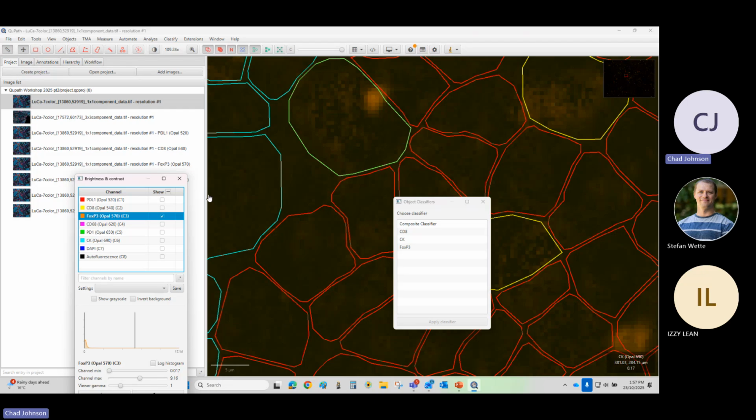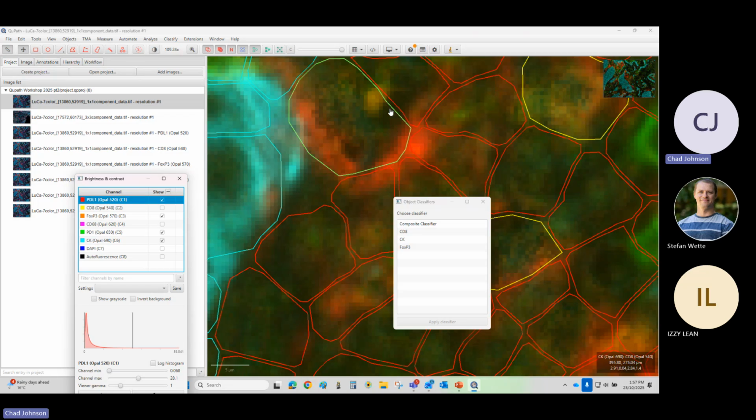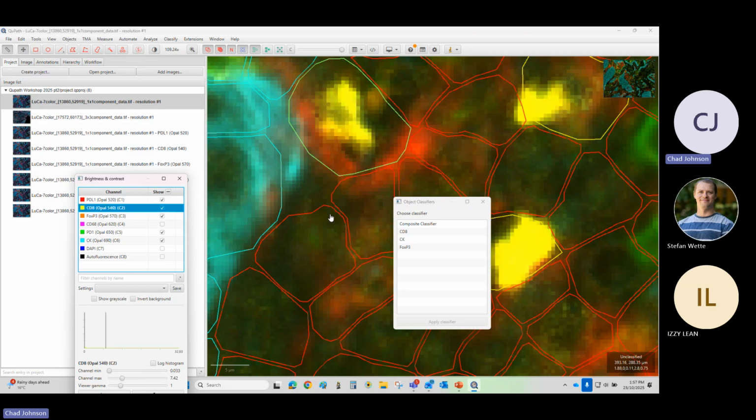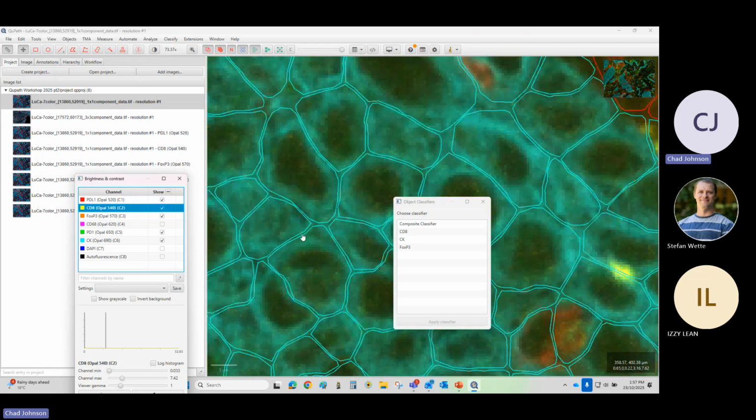It's also positive for orange as well. So you will get combinations of channels within a single cell, and it won't be a perfect blue or red, but a combination color. And that tells you that there are multiple markers, rather than a distinct single marker.